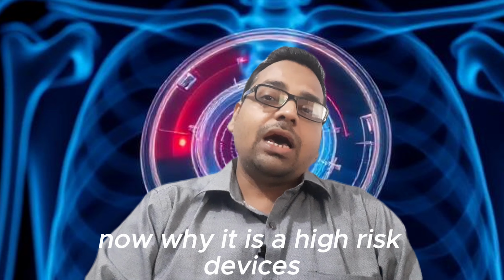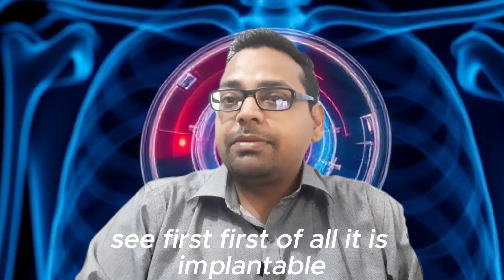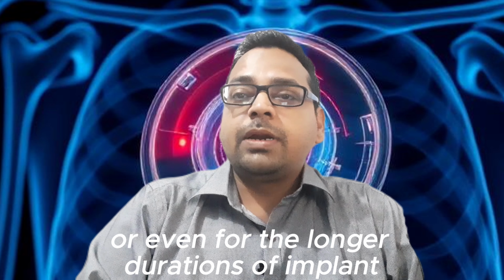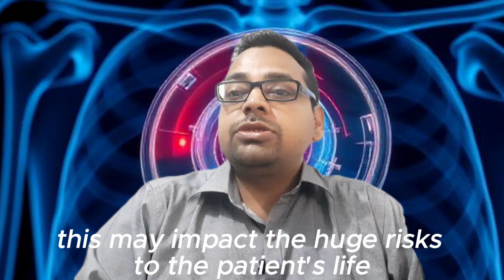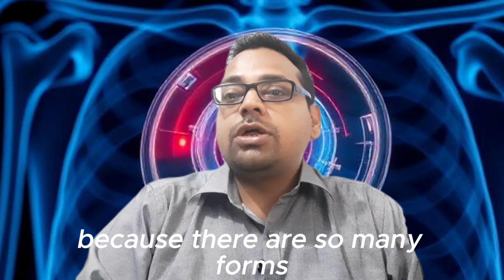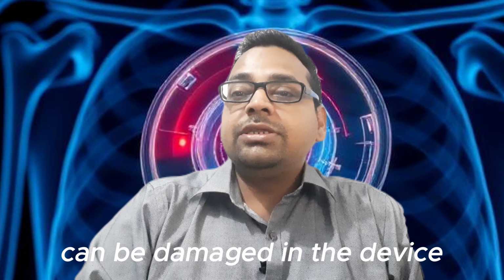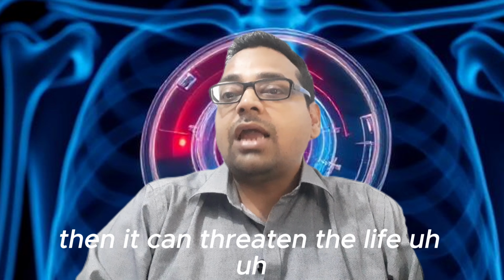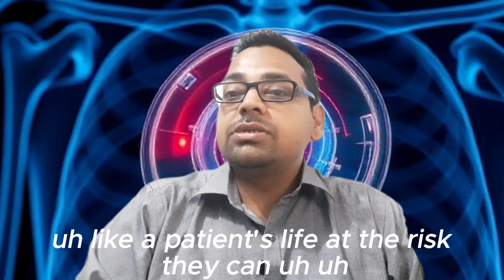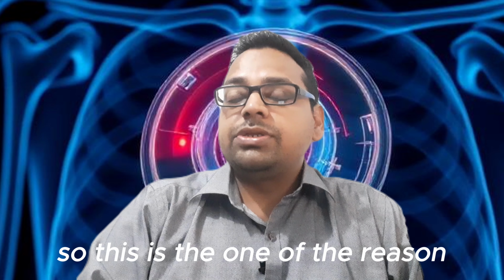Now, why is it a high risk device? First of all, it is implantable. So even for a while, or for longer implanting durations, this may impart huge risks to the patient's life, because so many things can be disoriented or damaged in the device, and then it can put the patient's life at risk. So this is one of the reasons.